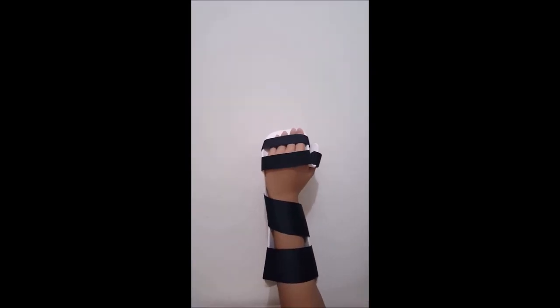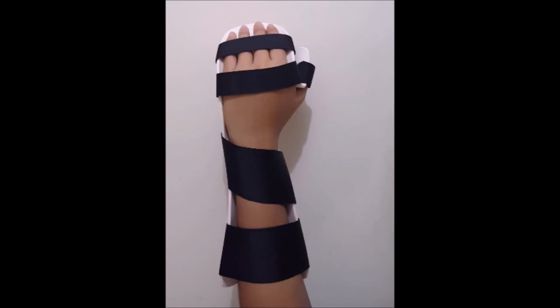Now let the client wear the orthosis for the first 30 minutes and observe for any pressure areas and make necessary adjustments. While waiting, you could instruct the patient for the orthotic care and orthotic use of the orthosis.